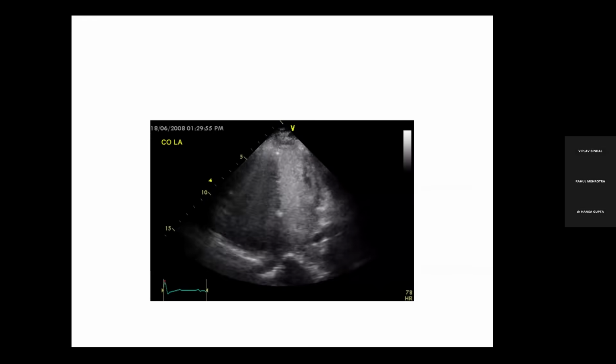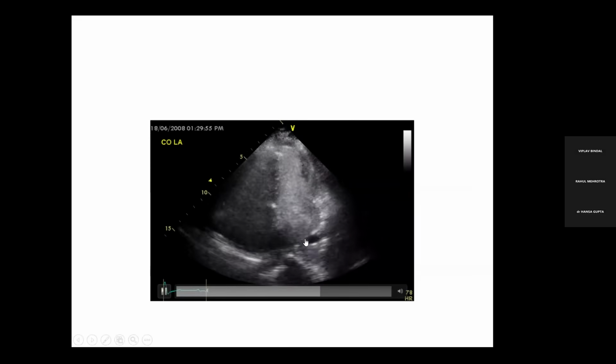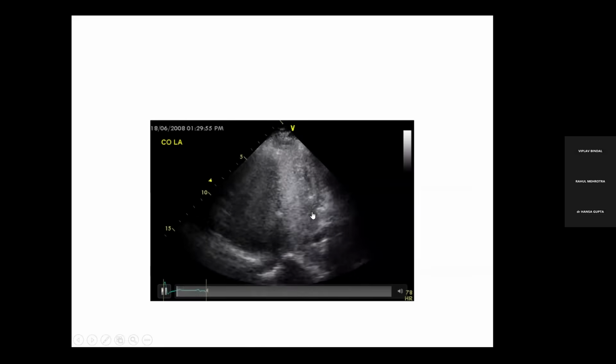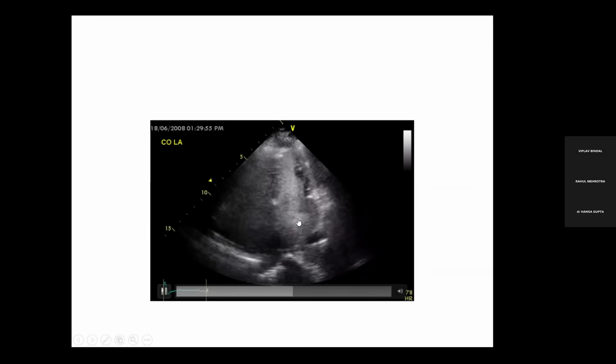And this is a follow-up picture of the same patient. The next few clips showed evidence of contrast in the LV and LA first, and then there was contrast spilling over to the RV and RA. And this is the patient I said collapsed immediately, became pulseless, and saturation dropped considerably. Now you can explain the complication. They do happen because these micro bubbles went into the coronary circulation and cerebral circulation.